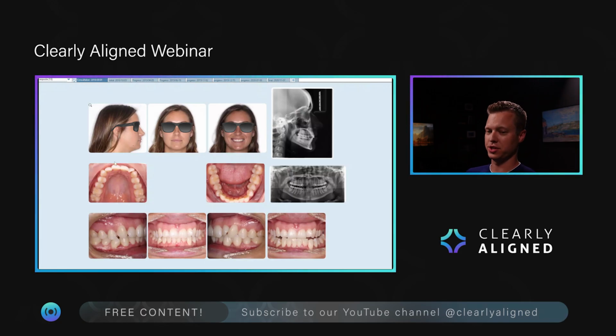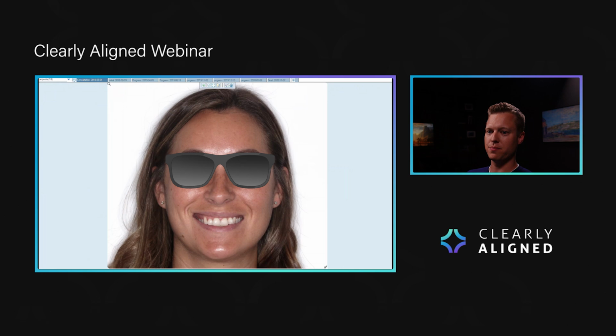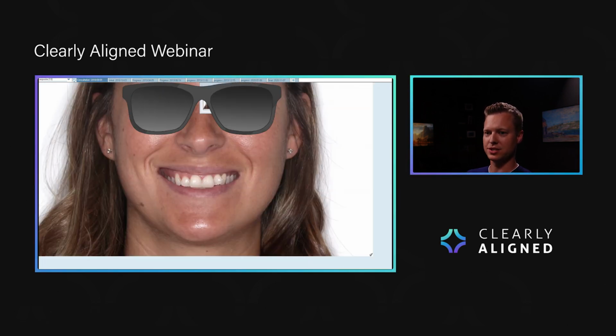We're going to start by talking about temporary anchorage devices, shortened to TADs. So what are temporary anchorage devices and when would you use them? So this is a patient who presents to our office. Some of you may have seen this case before, but many of you probably have not. This is just kind of like your level 1 of TADs. So what's going on here?